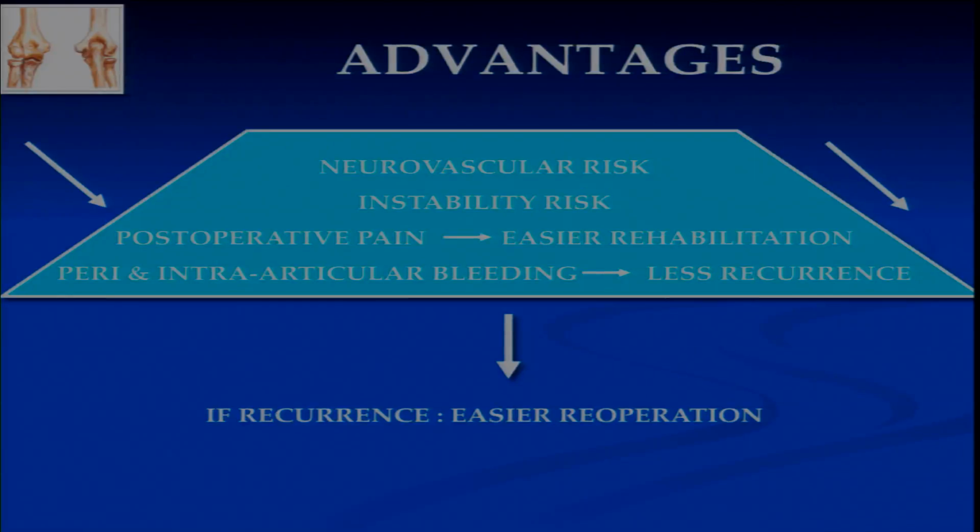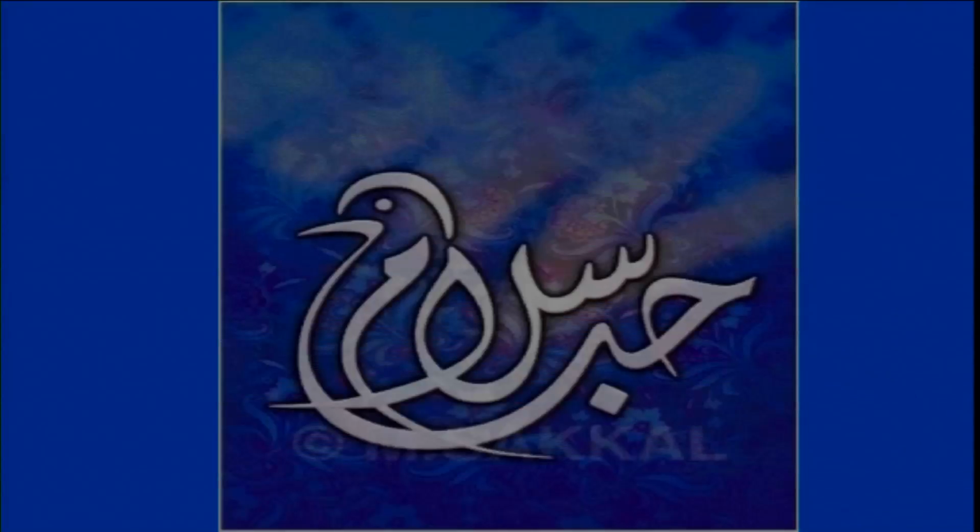So the advantage of arthroscopy, it's clear. There is less neurovascular risk, less instability risk. The post-op pain is really decreased with an easier rehab, and the peri- and intra-articular bleeding is less. That's why there is probably less recurrence and less drop down of the mobility after. And if recurrence occurs, of course, it's easier to reoperate after an arthroscopy procedure than after an open one.